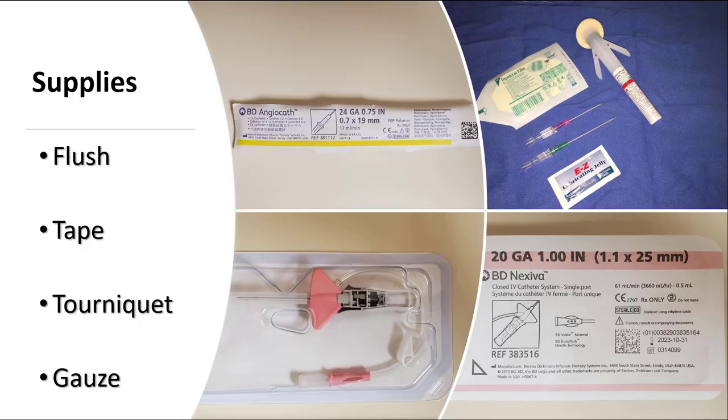In addition to your catheter and your ultrasound machine, you'll need to assemble some additional equipment: Tegaderm or other probe cover, skin prep solution, gloves, sterile gel, a tourniquet, gauze, sterile flushes, and a luer lock will be necessary.